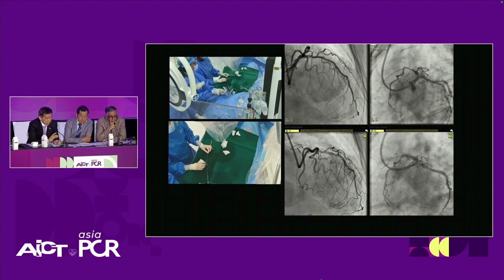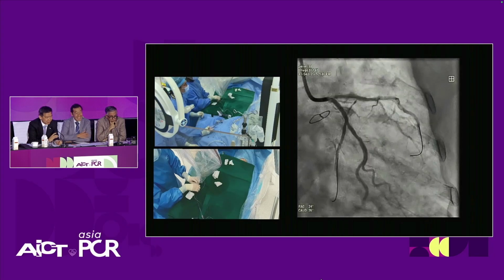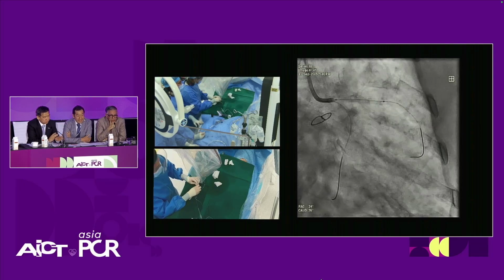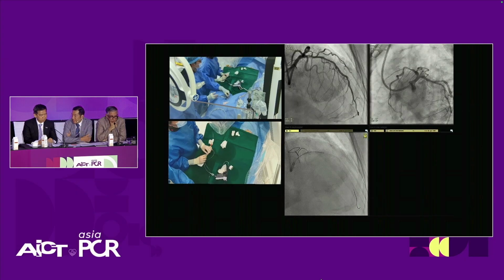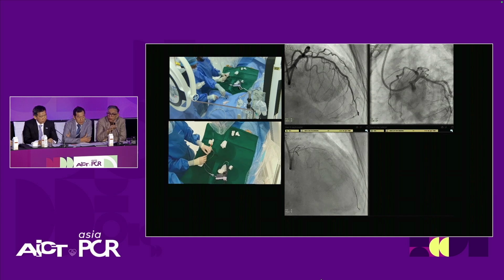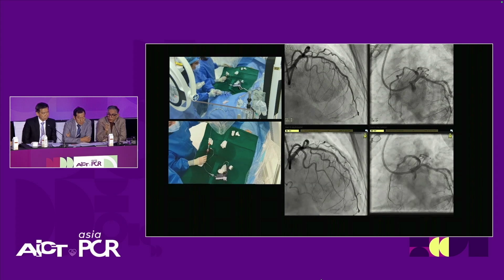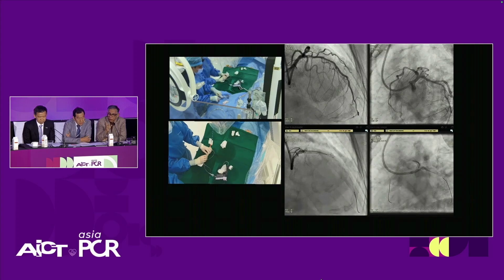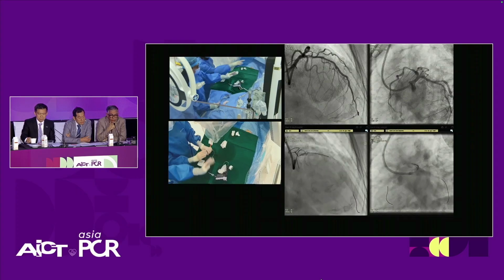I agree that if you use a DCB strategy, don't even look at the post preparation imaging. They're going to be ghastly. Look at angiographic dissection, A and B, non-flow limiting. I will accept that. I think that's borne out by anecdotal and all the case experience that we have. Sometimes we get scared off by the IVUS. But the dissection data is really related to stent and dissections. The adverse data for dissections in balloon only is not that substantiated. So I agree. If it looks good on the angiogram, just leave it and go.